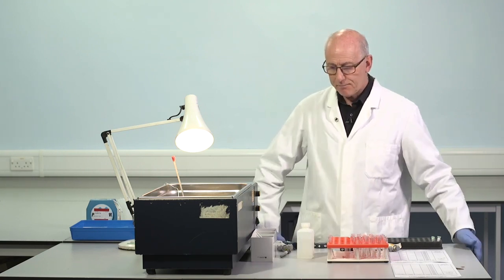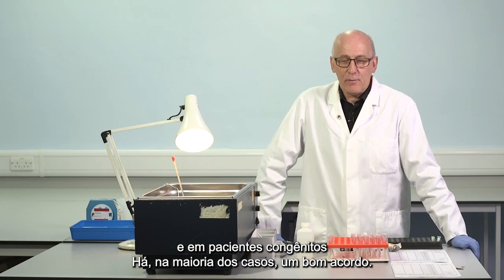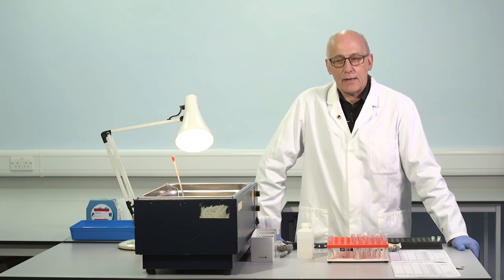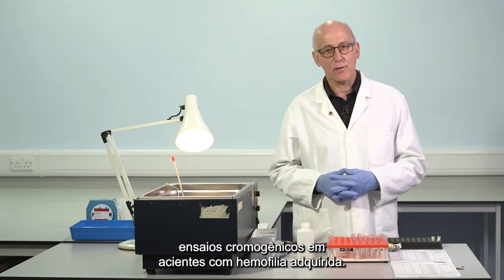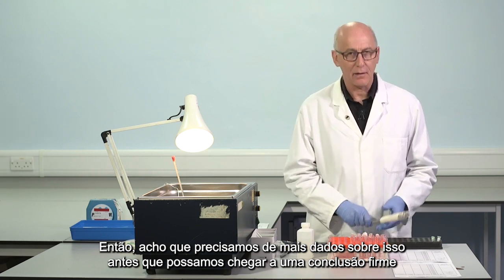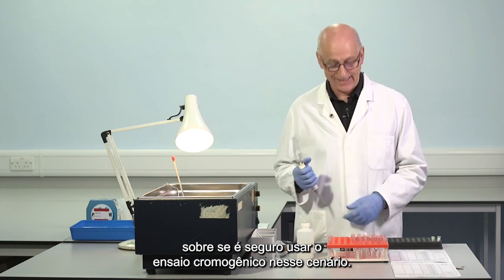In congenital patients there is, in most cases, good agreement, but it's very clear that there can be big differences between the inhibitor titers if we use chromogenic assays in patients with acquired haemophilia. So I think we need more data on this before we can make a firm conclusion about whether it's safe to use chromogenic assay in this setting.